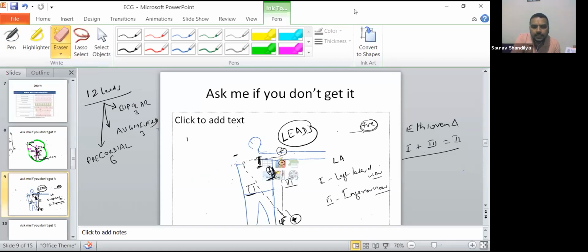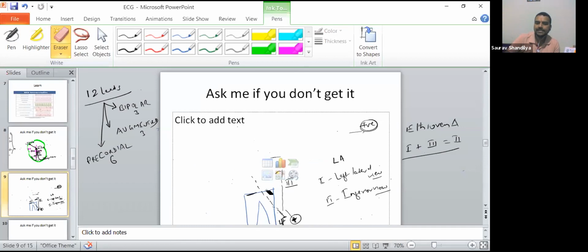No, there was no double positive. You can see there is a negative also on the left arm side. Once you go with the proper text, when you try to understand the leads, you will understand why it is important. It is just a bipolar lead.